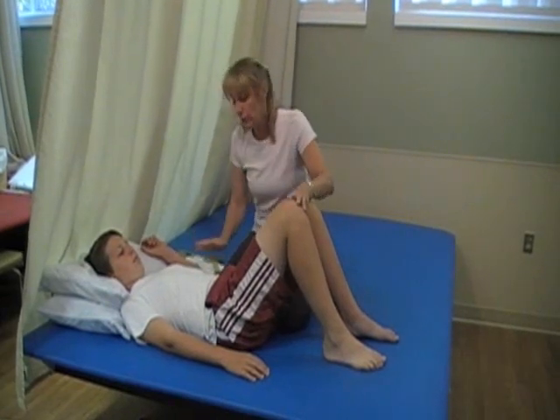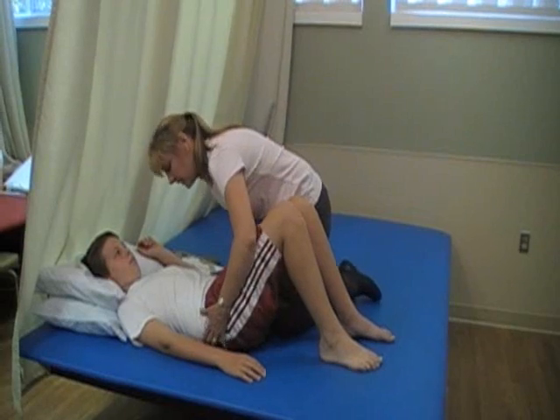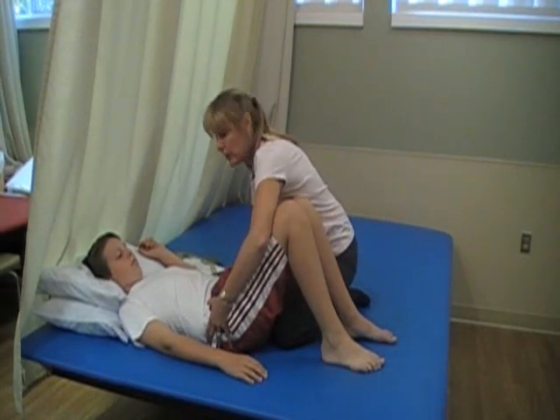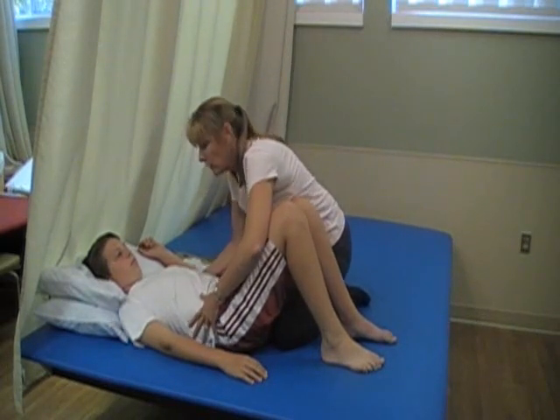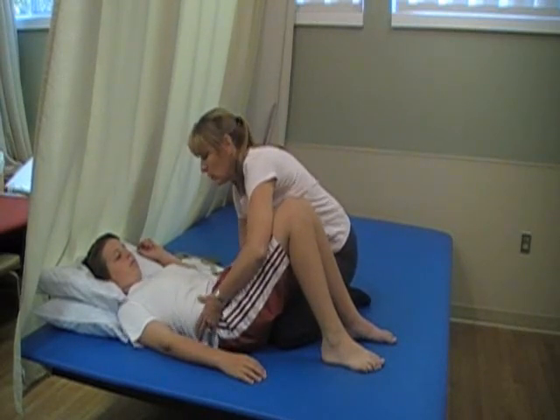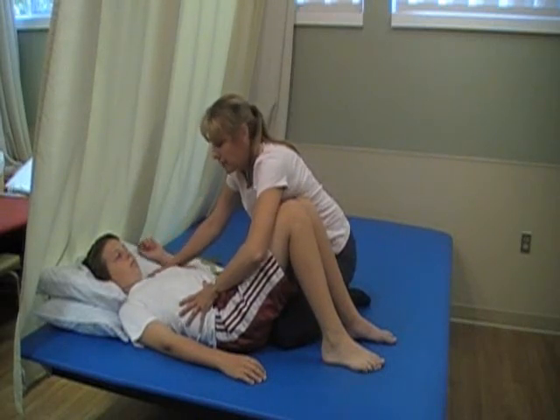So then the other thing you want to do is start to continue up the trunk and up the spine. Now your hips and your pelvis are in as close to optimal position as you can get. And then you want to look at the trunk. Are they contacting the surface on both sides, or are they rotated? Do they have a shift or a kyphosis where they can't touch their shoulders to the mat?